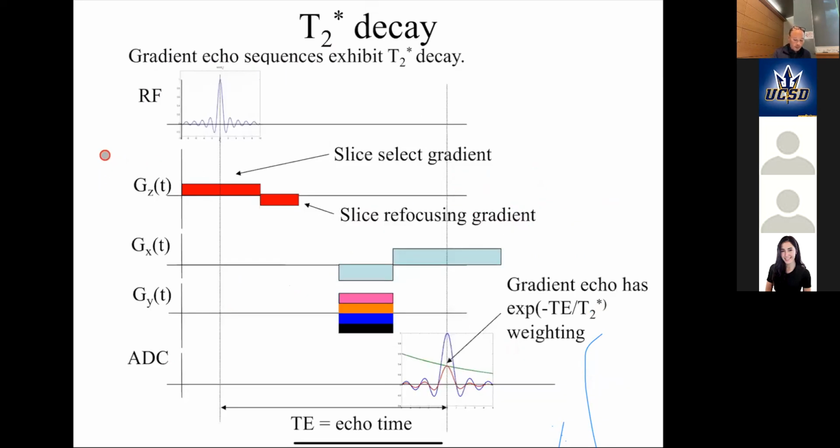So now we're going to introduce the term gradient echo, okay? Today we're going to talk about two things that you'll hear in MR all the time, gradient echo or spin echo, okay? And you can think of an echo as typically anywhere where we revisit kx equals 0. That's where we're going to define echoes. So for example, if we look at this, for now, we're going to ignore what this looks like. We'll talk about what this is doing, but we have an RF pulse that excites the magnetization. And here you're seeing the spin warp gradients we talked about before, where this is the readout gradient and these are the phase encode gradients, okay?